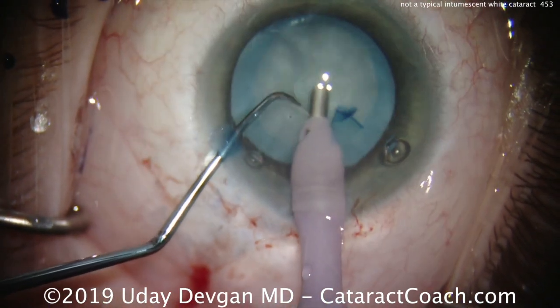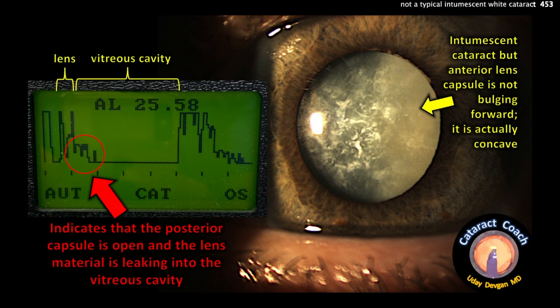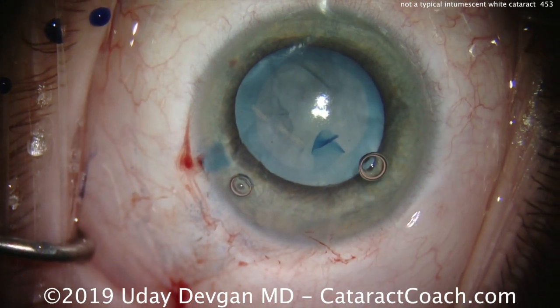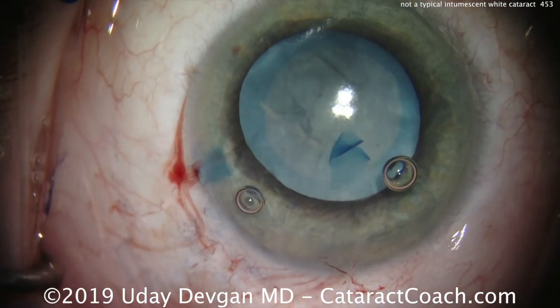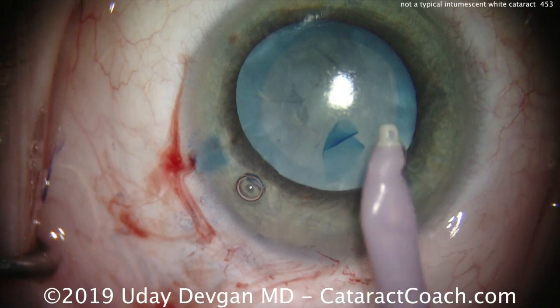but look what happens with that infusion pressure. Suddenly it starts to look a lot deeper, and then we try to aspirate, and it's all gone. It's just gone. So certainly the issue here is, look at that A scan. The posterior capsule's already open, and the lens material was already leaking into the vitreous cavity at the time of my pre-op consultation. That's the issue. During the initial vitrectomy, the posterior capsule was inadvertently violated with the vitrector. And so now there's no chance of getting this up through the anterior segment, especially in an eye that's already had a vitrectomy. These lens material pieces fall back to the posterior segment very quickly.